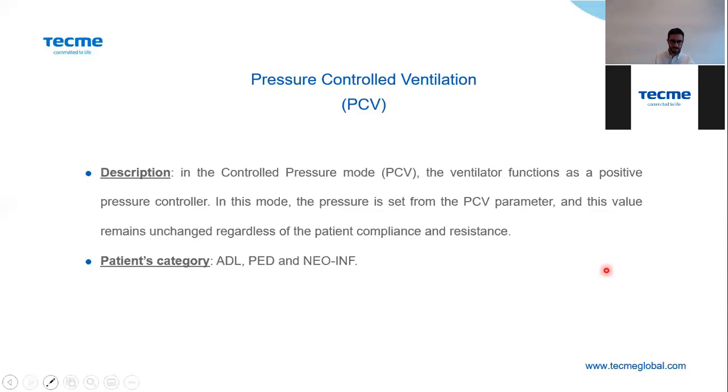So the ventilator delivers a certain amount of pressure to the patient, and that's it. It is available in adult, pediatric, and neonatal patient categories.